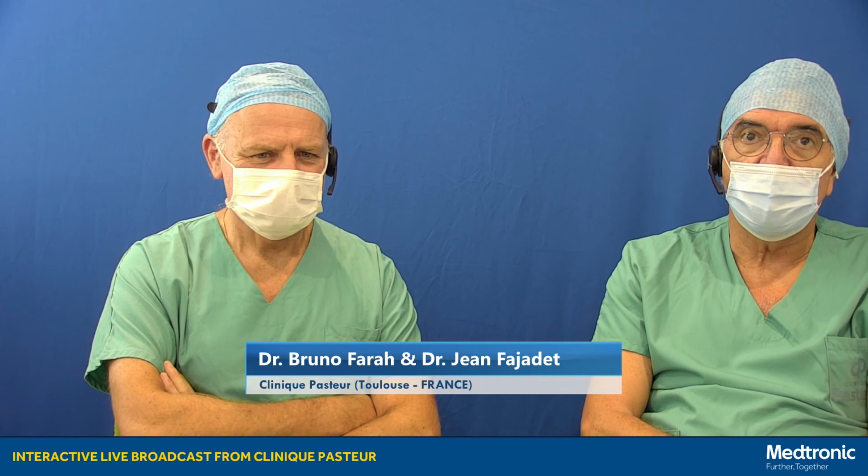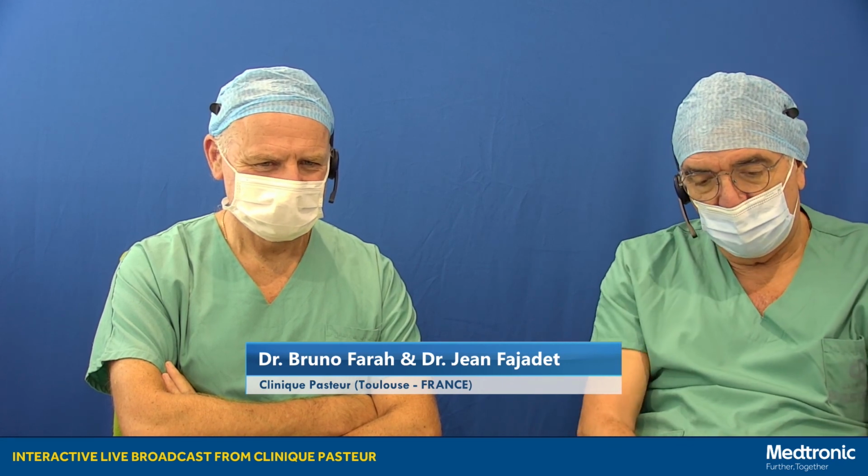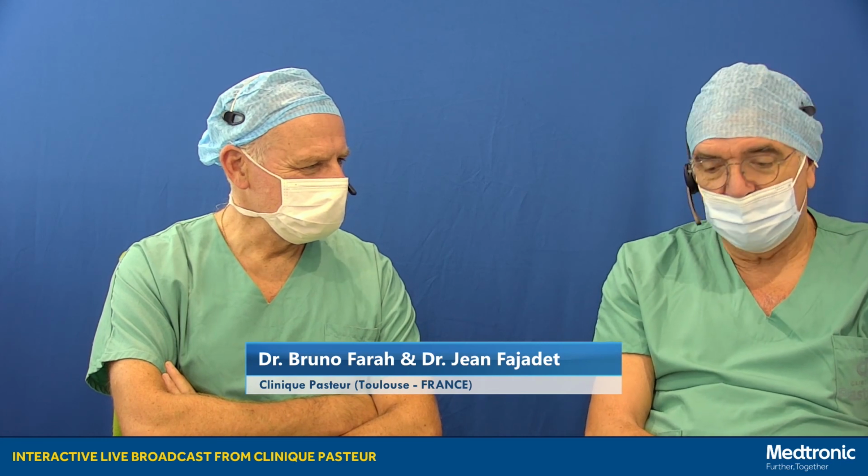Yeah. Again, thank you. It was a pleasure for Bruno and myself to transmit this procedure for this webinar. Thank you to Medtronic for supporting this educational case. And I hope that this case was interesting, and you learned something. We learn every time we are doing a procedure, and this will be useful for your daily work in your cath lab.